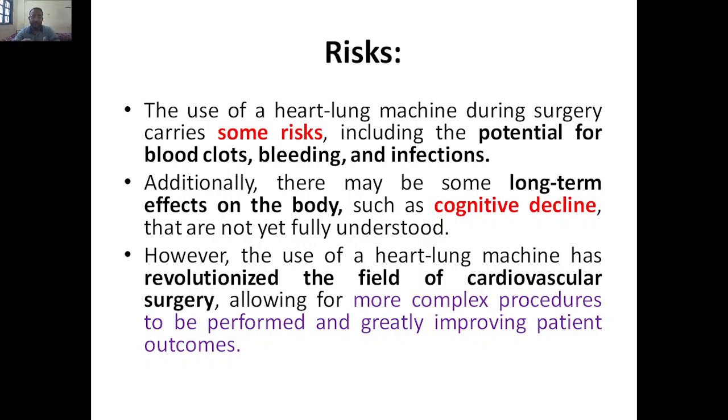When you are doing open heart surgery, you might have extra bleeding. If any other capillaries are cut, it will bleed, and during that time the blood will not come to the machine only. Or when the blood is pumping, because of the flow rate, it may cause the capillaries to open up, so bleeding might be there.